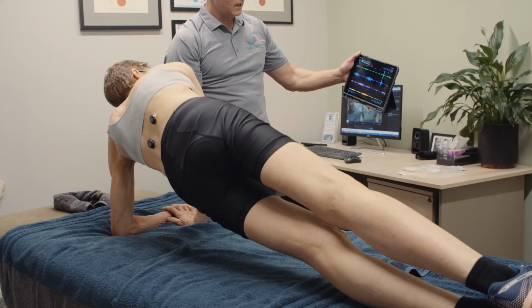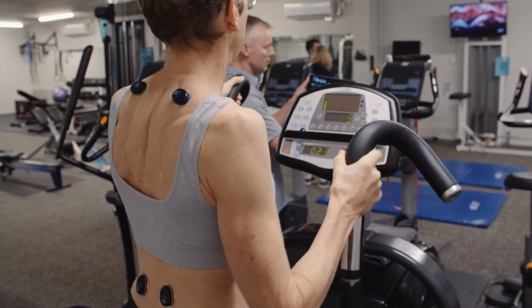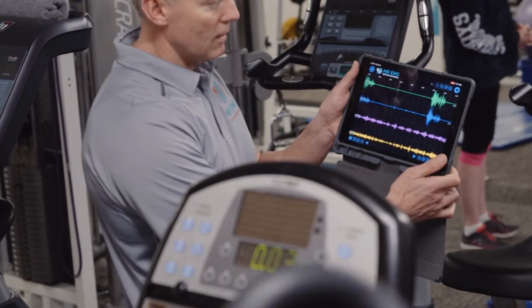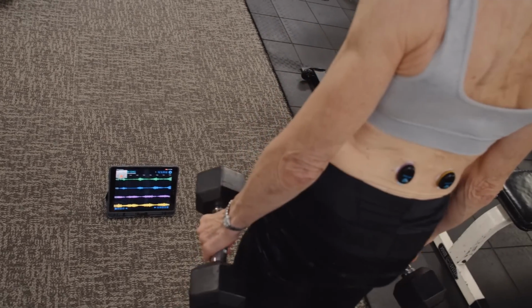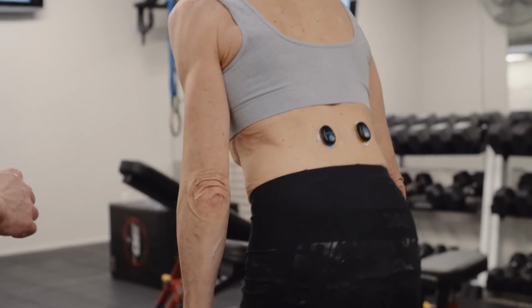lastly side bridges. We will complete our data gathering for this subject by performing 2 gym exercises, starting with using a cross trainer and finishing with dumbbell deadlifts. The exercises you test are entirely up to you, the clinician, and what you would deem most appropriate for each subject based on their symptoms.